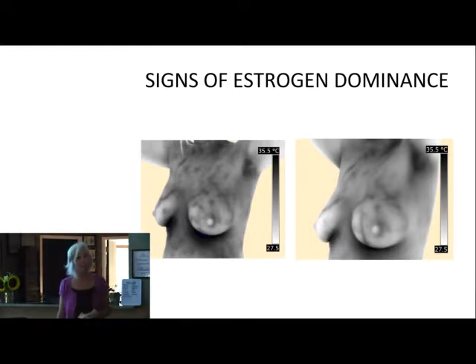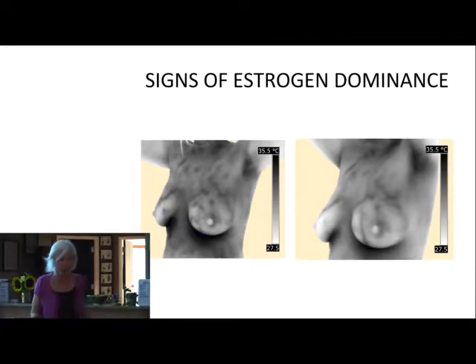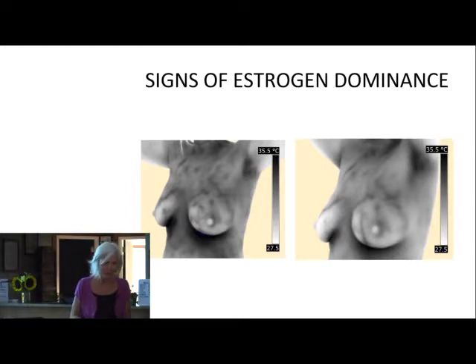So we can see a lot of things like this in the images that can help us discuss what's causing your high-risk thermogram. What's causing the heat in your breast? Is it hormones? When we see this kind of pattern, I have to talk about hormones. Are you having other hormonal symptoms? How is your stress level? I talk about reducing stress. That's another common denominator in disease and health. You've got to manage and reduce stress because we know it affects every single part of our health, including the breast.